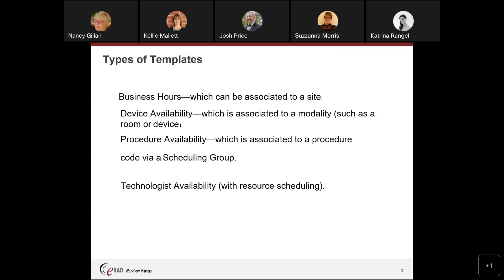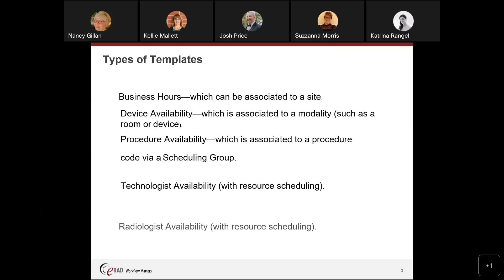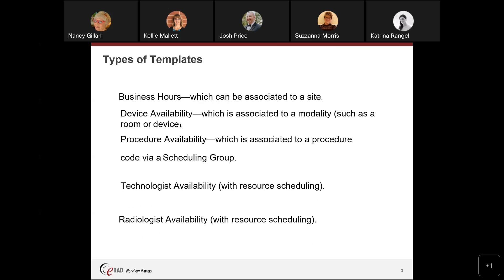With resource scheduling, we have tech availability and radiologist availability. We're not going to go into resource scheduling today — that can be a webinar all in itself — but we will have to touch on it through this presentation.